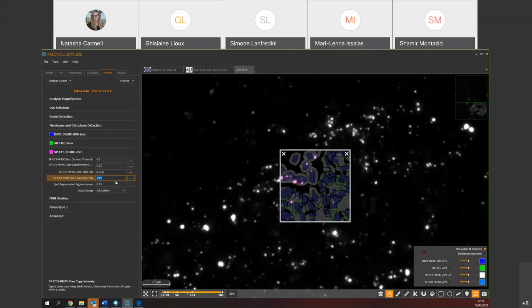If you set this too low, of course all the spots will be taken into account as multiple spots, while if you set this too high, all your spots will be recognized as only one spot. We do not have a markup image change as previously, but you will see a difference in your results afterwards. When you look at your number of probe counts, it will be completely different according to this parameter. So set this carefully. As I mentioned, a good way to do this is to go into the results and check what's the intensity of one spot, and input this value here.